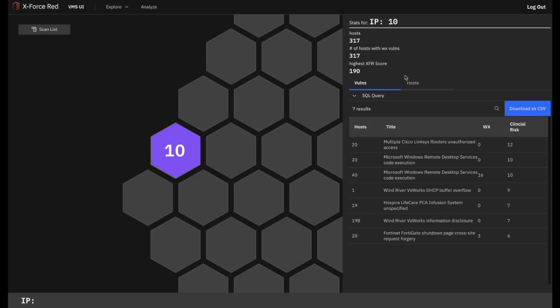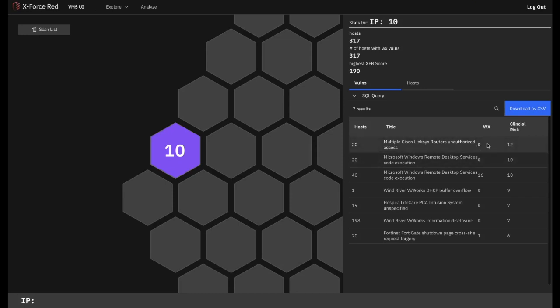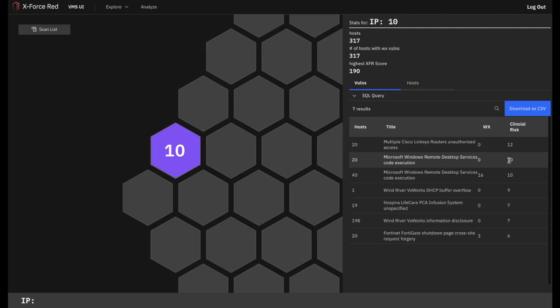Under the vulnerabilities tab, you see a description of the vulnerability or its CVE ID, the number of assets it's being detected on, how many weaponized exploits are there in the wild for this, and finally, on a scale of 1 to 12, the highest clinical risk score associated with an instance of this vulnerability in the network. Here, we can see that a number of these vulnerabilities score rather highly in terms of risks to patient safety. There are instances scoring at 12 out of 12, and 10 out of 12, and a number being on a significant range of assets.